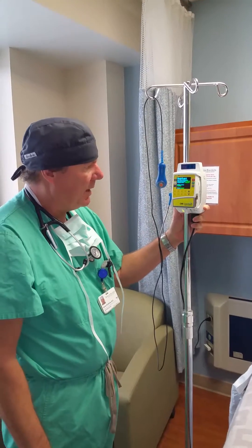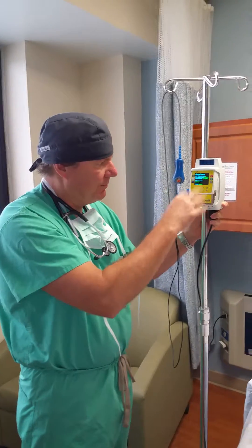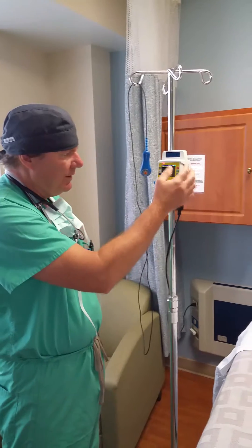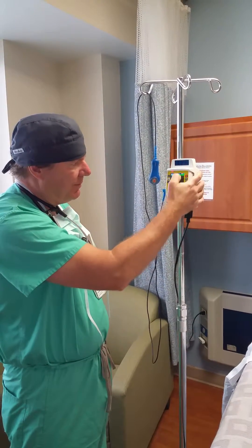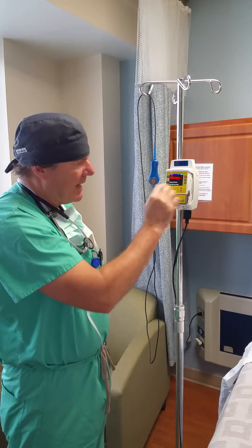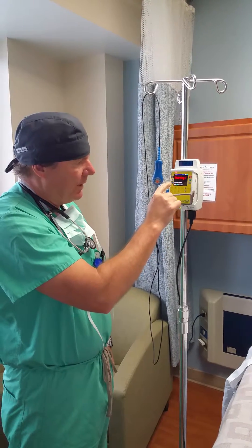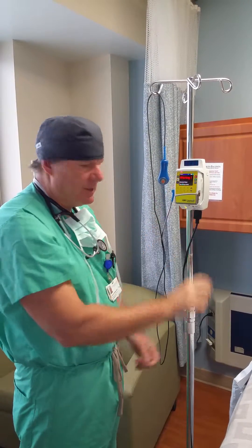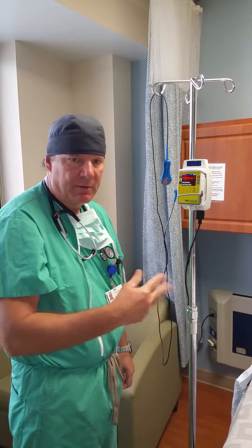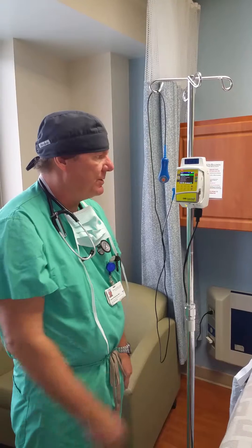Once we close it and turn it on, the pump has a mechanism here to prime. We press stop, it says prime, so we hit start. It'll give a warning — you want to make sure you disconnect it from the patient before you prime, because you don't want to give the patient a huge bolus.